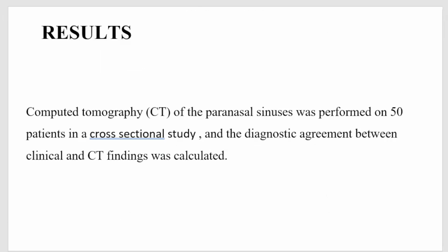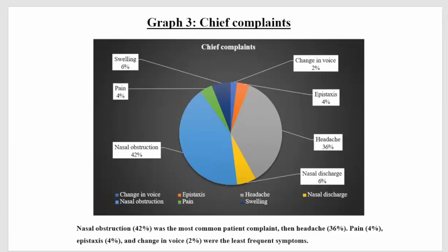Computed tomography of paranasal sinuses was performed on 50 patients, and the diagnostic agreement between clinical and CT findings was calculated. This is the result. Results. The chief complaints include swelling, pain, nasal obstruction, change in voice, epistaxis, headache, and nasal discharge. Nasal obstruction and headache are the most common complaints here.